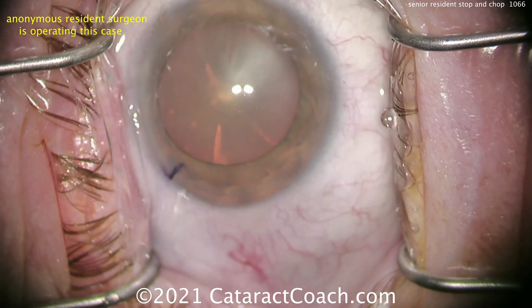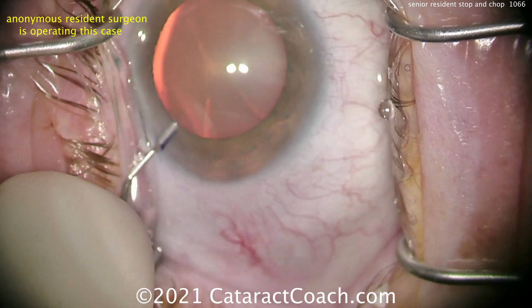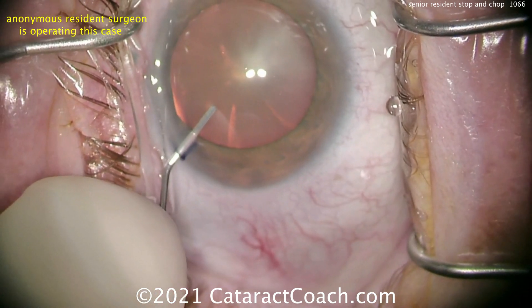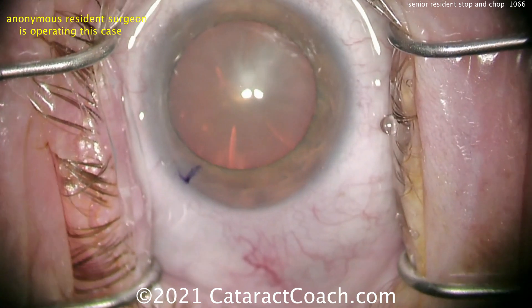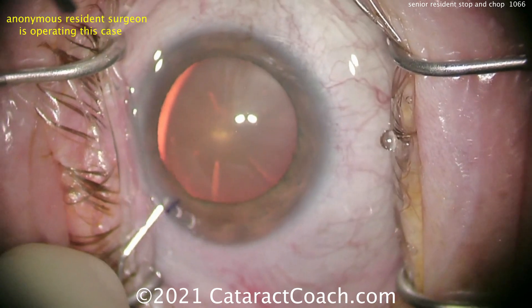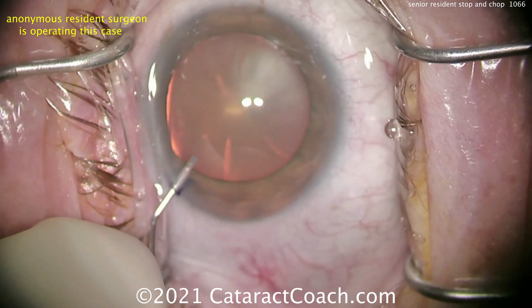There's the paracentesis. Notice that the blade was inked prior to making the paracentesis, so it stains the corneal stroma temporarily, making it easy to see the position of that paracentesis. The draping looks pretty good — all the lashes are out of the way, the lid margins sequestered. I like that. Excellent job here.